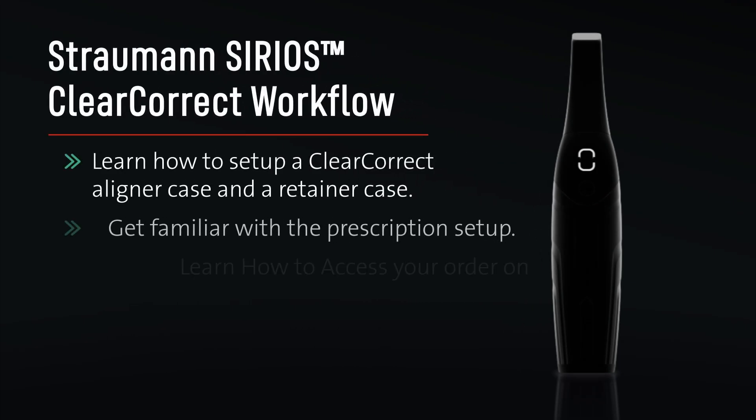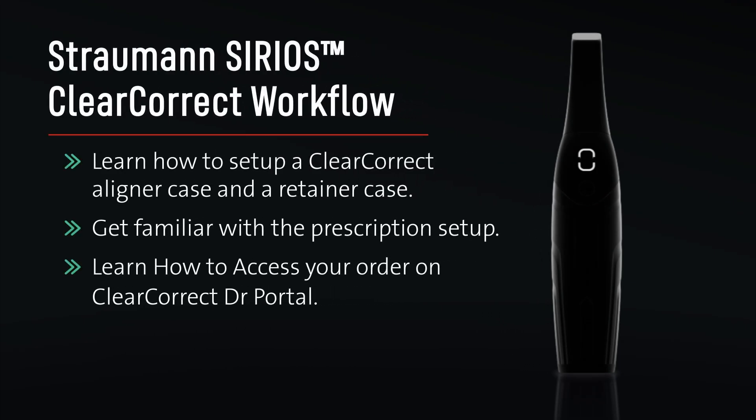Straumann SIRIOS ClearCorrect workflow. Learn how to set up a ClearCorrect aligner case and a retainer case, get familiar with the prescription setup, and learn how to access your order on ClearCorrect Doctor Portal.